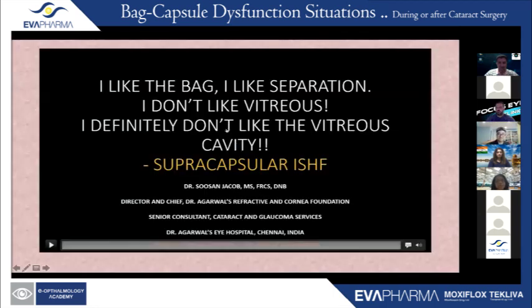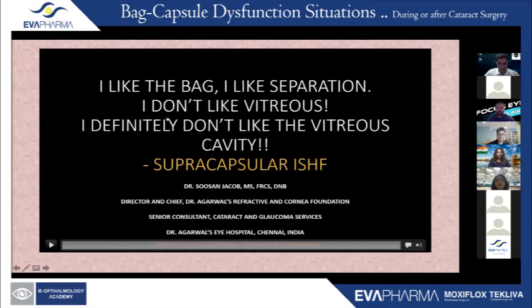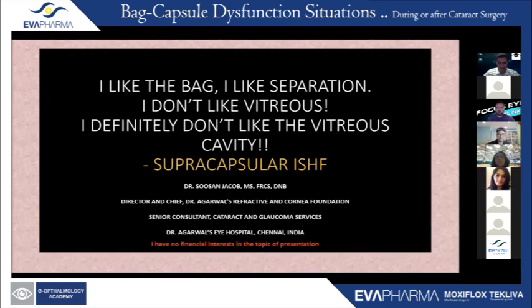Now, this particular case that I'm showing was also chosen for the Challenging Cases Symposium at this ASCRS. The name is quite long, but I think it makes sense to all of us attending this webinar today, because we like the bag, we like separation. And by separation, I don't mean the separation that the coronavirus has caused for us, but basically separation of the anterior chamber, the posterior chamber and the vitreous cavity. So we don't like to mix up the vitreous into the anterior segment as far as possible. I definitely don't like entering the vitreous cavity if possible.